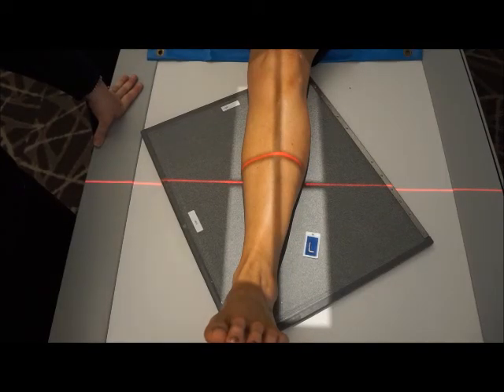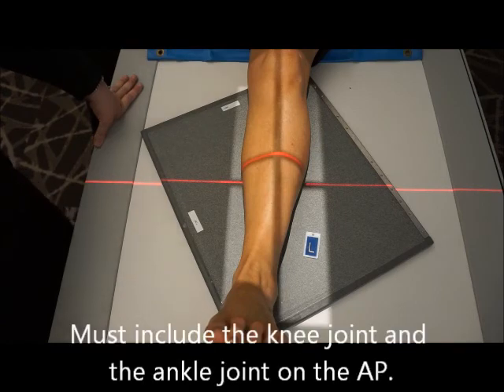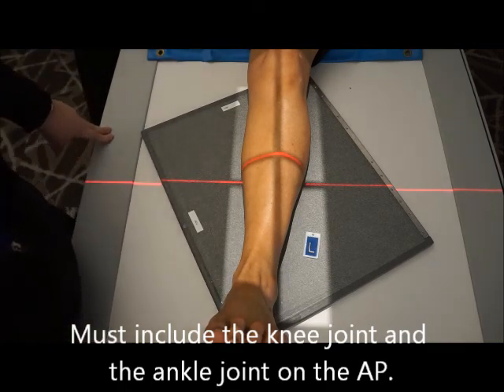This is a two-view lower leg or tib-fib, tibia and fibula. On this particular image you have to make sure that you're getting the knee joint and the ankle joint. So we have to find a happy medium.